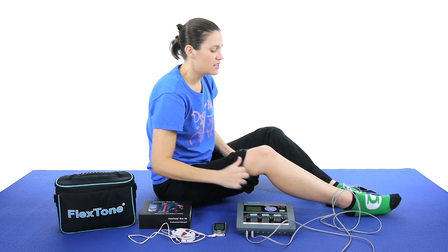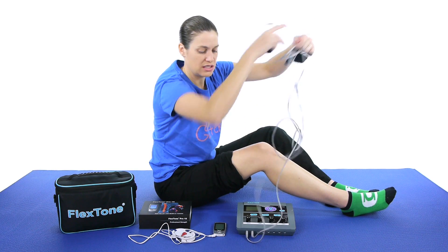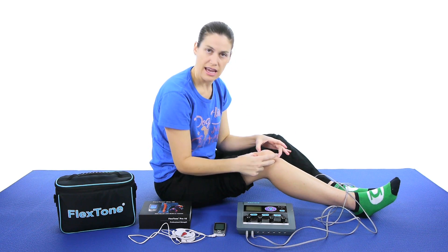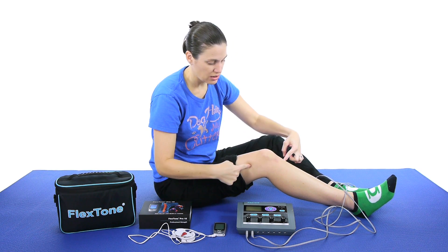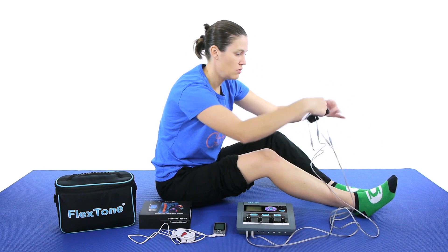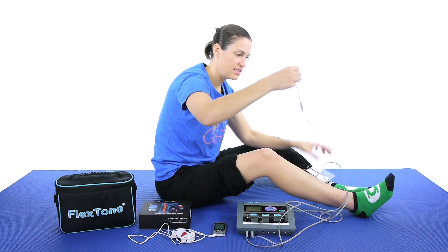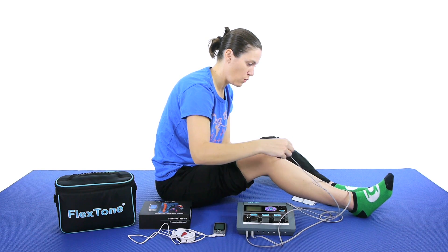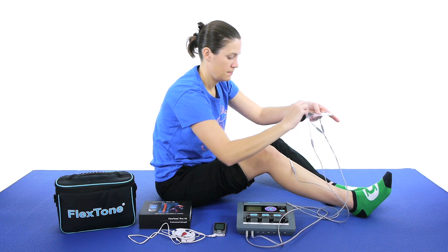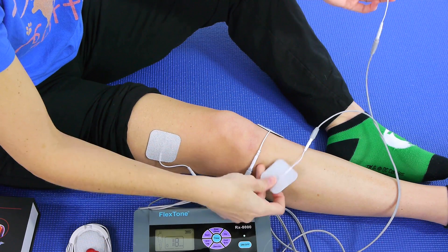With the TENS, the way you want to do it is a cross pattern. There are 2 channels — you want to cross them so the currents go to where you're kind of hurting. So let's say it's on the knee. If I'm hurting kind of on that kneecap area, I'm going to put 1 channel here and 1 channel here. So I'm going to go ahead and do that now. You can see they're connected there, and what's nice is you can actually pull them a little bit — they're connected but you can separate them without messing them up. So I'm going to put one over here, then the other one over here, just like that.